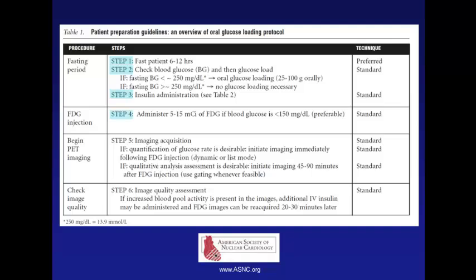You give then the FDG, and then you make an image acquisition. Sometimes in type 2 diabetes, I have almost no uptake in the myocardium. It's important that you tell your techs, show me the images immediately, because you can see this, and you can rescan. You can add insulin, and then you can rescan. Half-life is 2 hours, no problem.